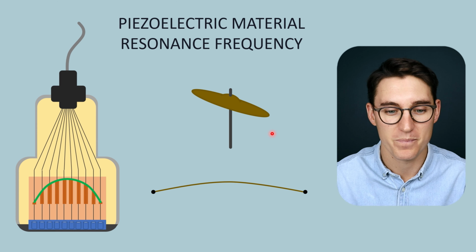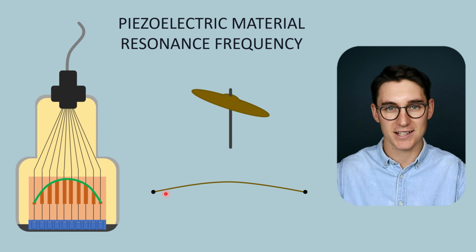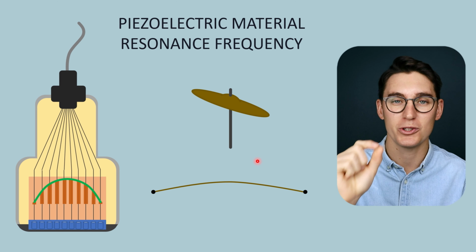The second way I like to think of a PZT material is as a guitar string, a string that is held between two fixed points here. Now when you strum a guitar string, a certain note is played.